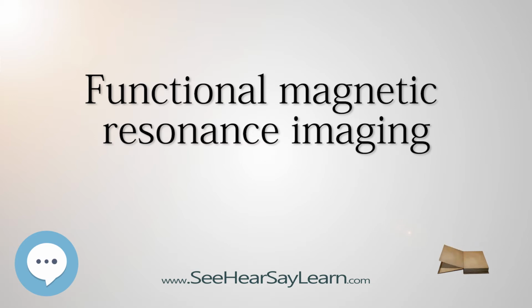Clinicians also use fMRI to anatomically map the brain and detect the effects of tumors, stroke, head and brain injury, or diseases such as Alzheimer's, and developmental disabilities such as autism, etc. Clinical use of fMRI still lags behind research use. Patients with brain pathologies are more difficult to scan with fMRI than are young healthy volunteers, the typical research subject population.